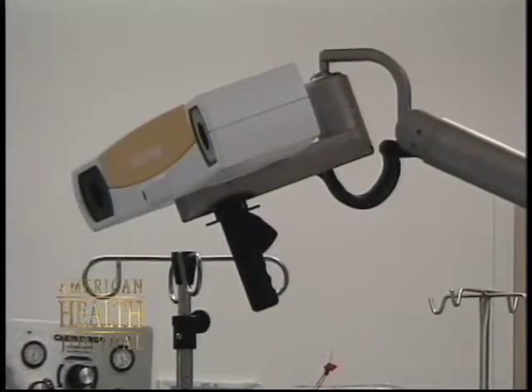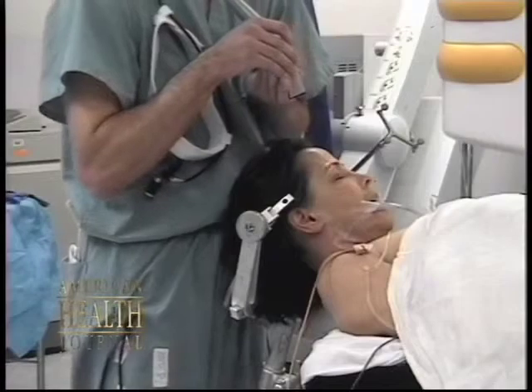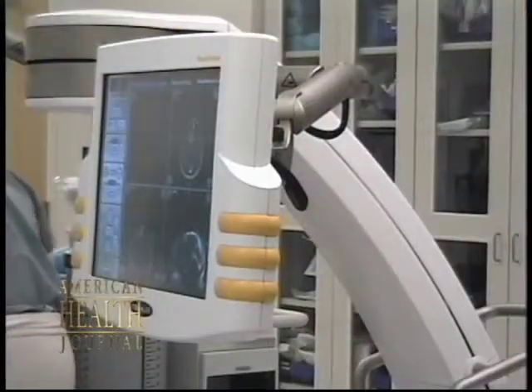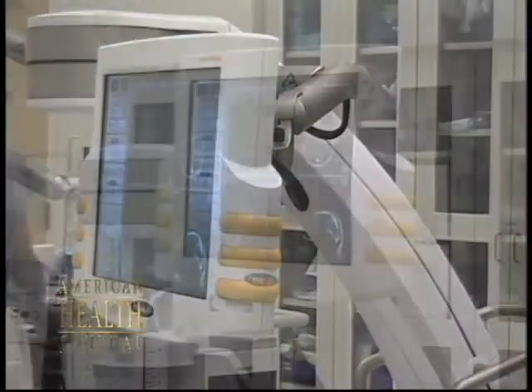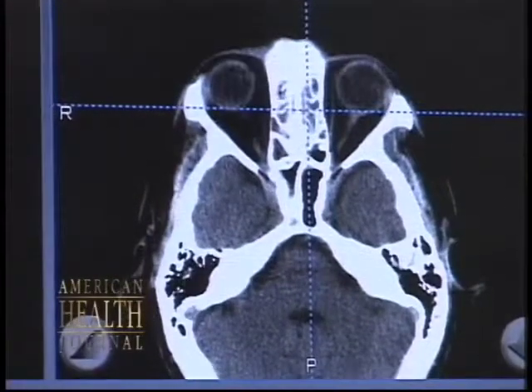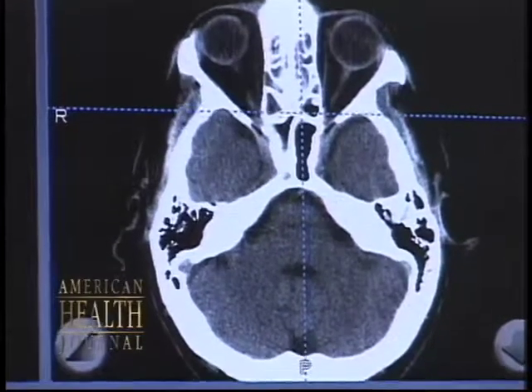So after the patient's completely prepped and draped and asleep, and we've scanned them into the software, you have a monitor that has a three-dimensional display of exactly what anatomy is being pointed to by your probe during surgery. So as you make your incision, you simply take the probe and you overlay skin or other structure that you want to identify, and it shows you in 3 dimensions what that structure is in relationship to the rest of the anatomy and makes it very easy to identify.